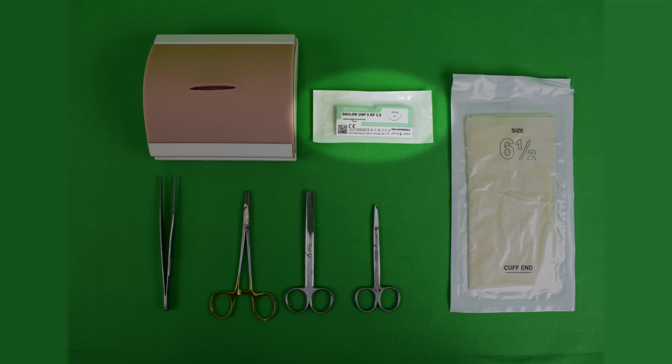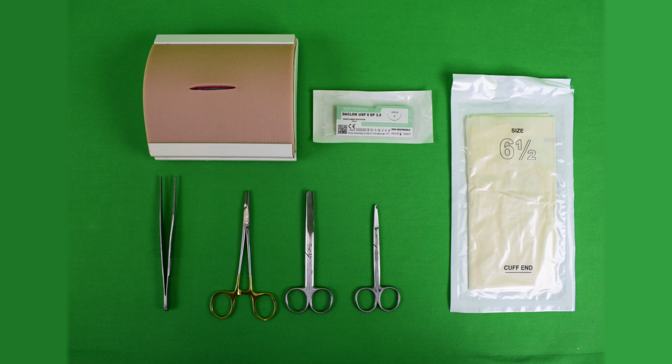Traumatic suture needles come separate from the thread, meaning that the suture material must first be threaded through the needle's eyelet. Due to the wider eyelet and the folded thread, a larger trauma of the tissue is created. Traumatic suture needles should only be used on more robust tissue such as muscle or fascia.